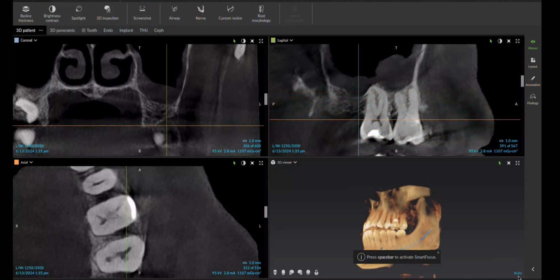With that said, when we take an image, we are responsible for the contents of that image. So developing the eye to identify when something doesn't look right, and then sending it off to an oral radiologist, oral surgeon, or somebody else that's an expert in the arena where the entity might be located. But the topic of today's conversation is really non-odontogenic pain.